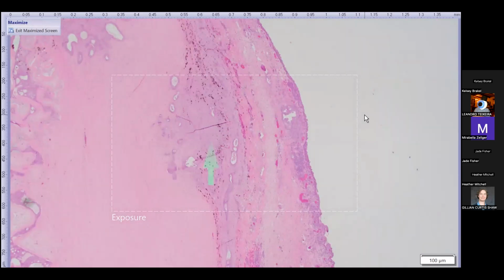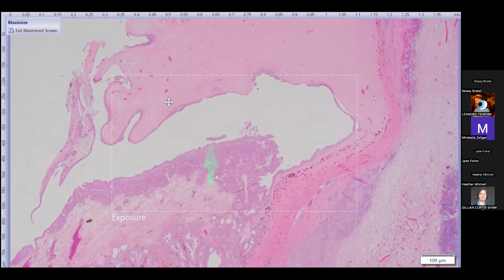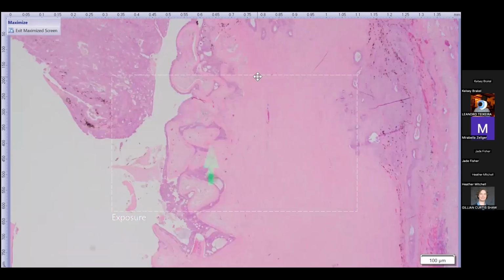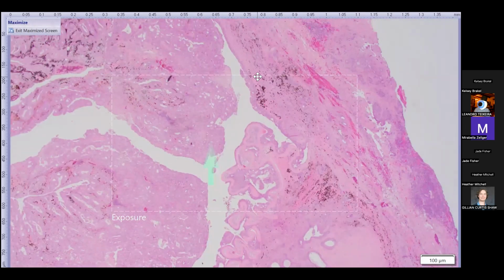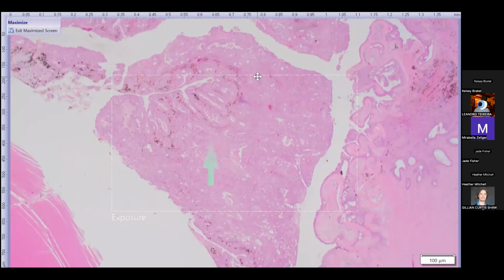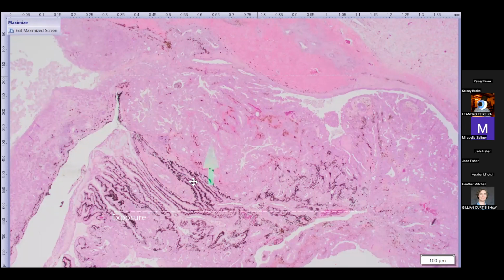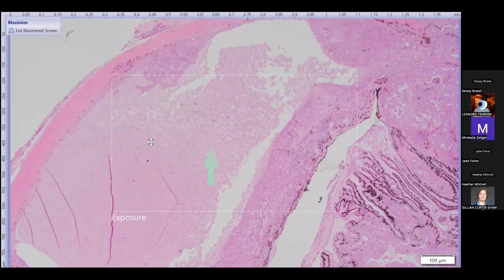We can already see a lot of these tubules coming into view here, and a thick sort of purple layer lining the inside of the cornea. You can actually follow the back of the cornea here. It's very, very wrinkled, part of the phthisis bulbi they described. And this similar tissue is effacing the iris and the ciliary body. You can just make out some of the plicae here, sort of embedded in this abnormal tissue. And here's that area where it was invading the choroid or suprachoroidal space with a big necrotic center and similar tissue at the edges.